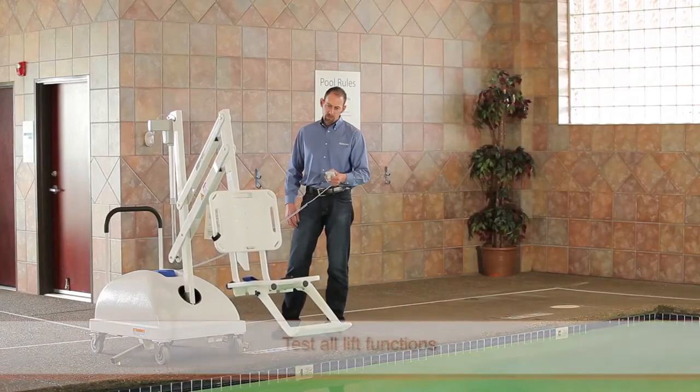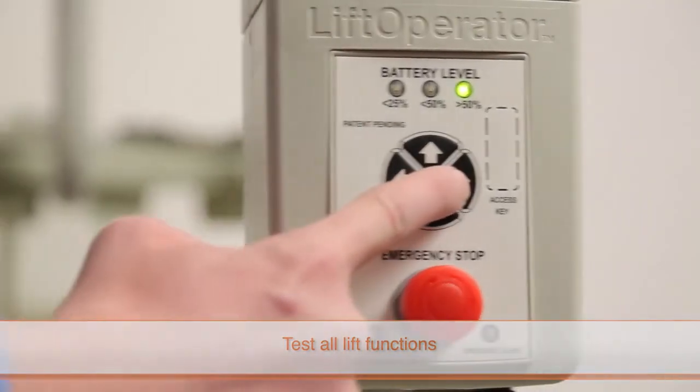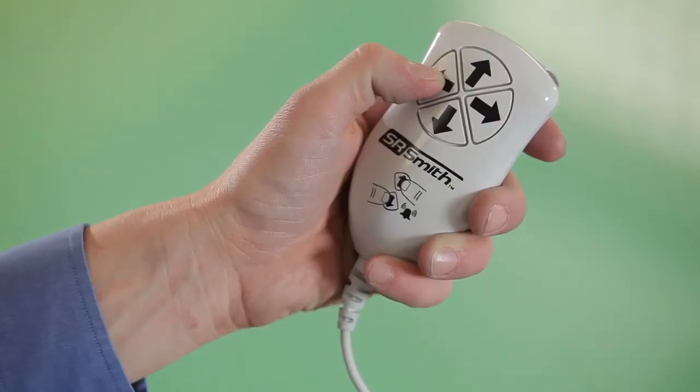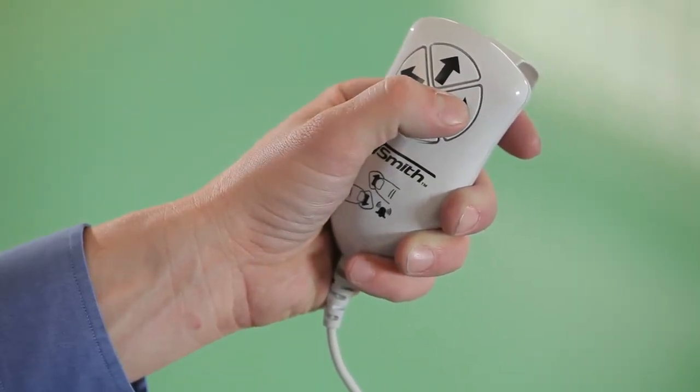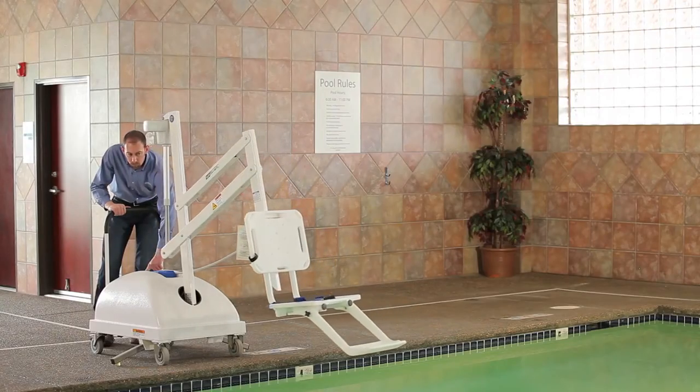Make sure to test the lift functions after replacing either the motor assembly, motor cable, tension spring, or gears, using both the touchpad control and the hand control to confirm that the lift is functioning properly after installing any new parts.